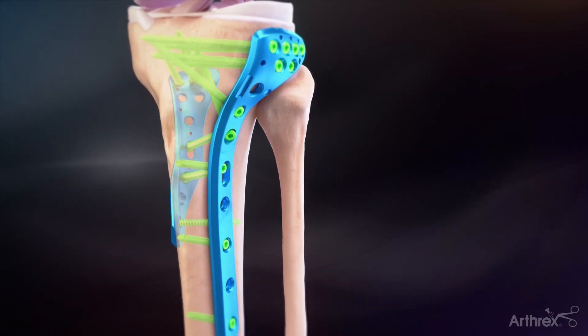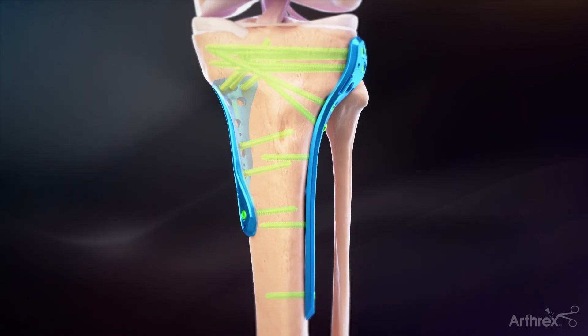The lateral plate has two rows of proximal rafting screws and two kickstand screws to address various fracture patterns.